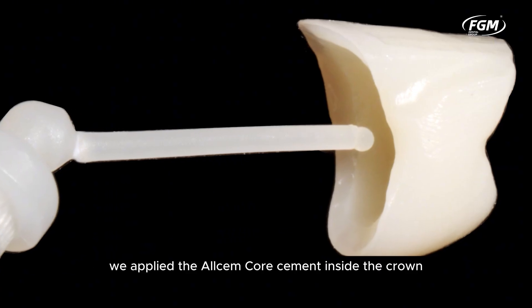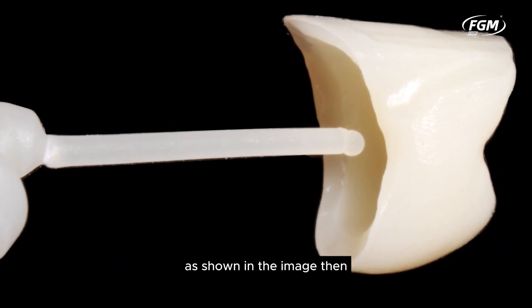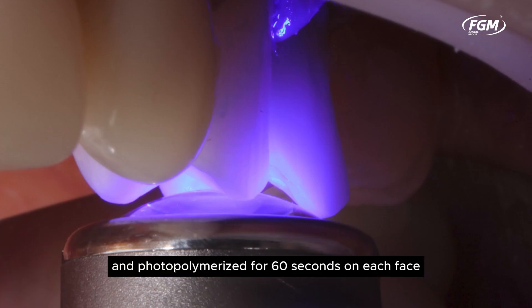We applied the AlcemCore cement inside the crown as shown in the image, then positioned the crowns and photopolymerized for 60 seconds on each face.